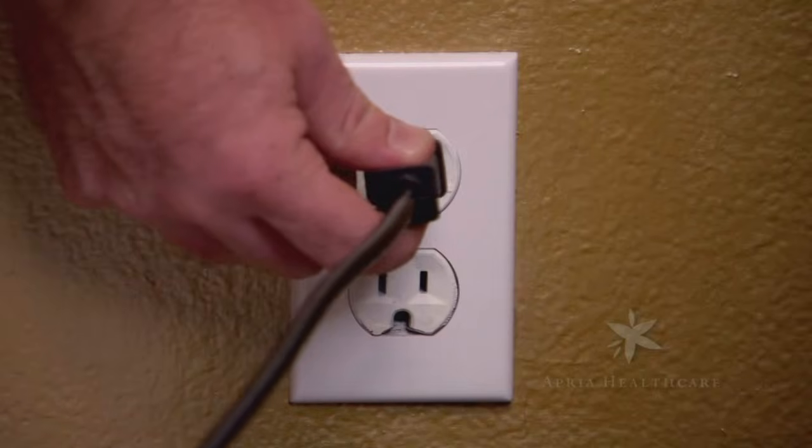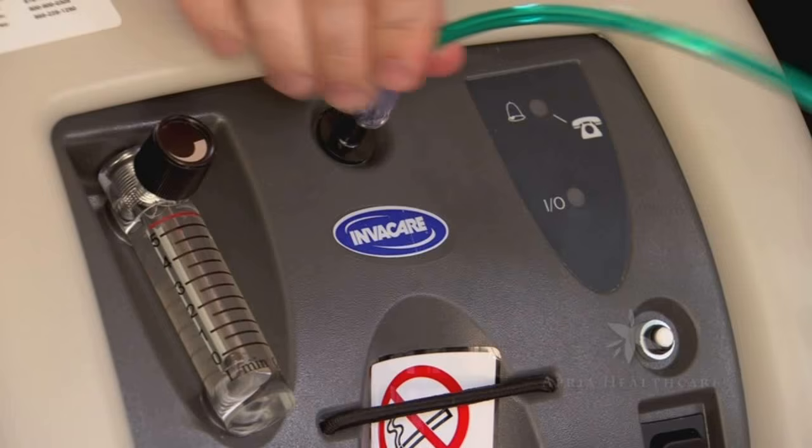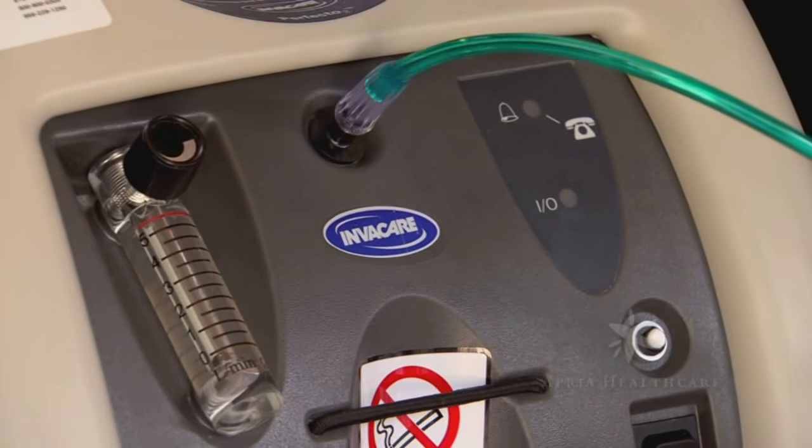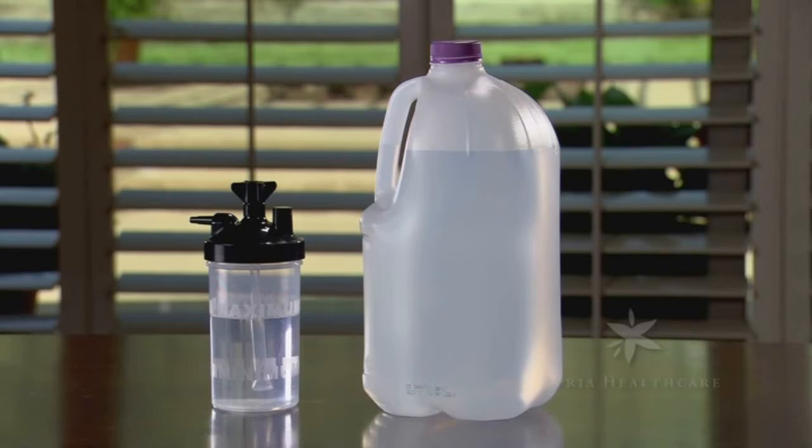Insert the power plug into a power outlet. Unless your physician has prescribed a humidifier bottle, attach the oxygen tubing to the nipple outlet. If your physician has prescribed a humidifier bottle, attach a filled humidifier bottle with distilled water.